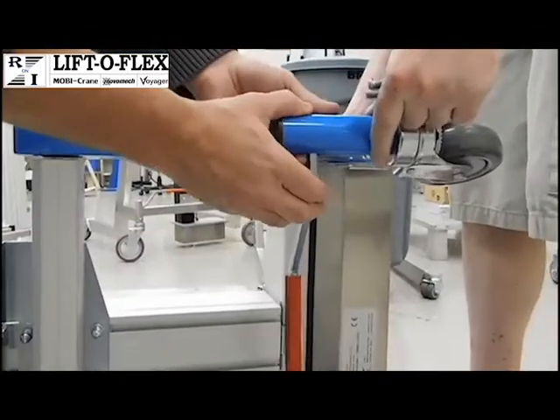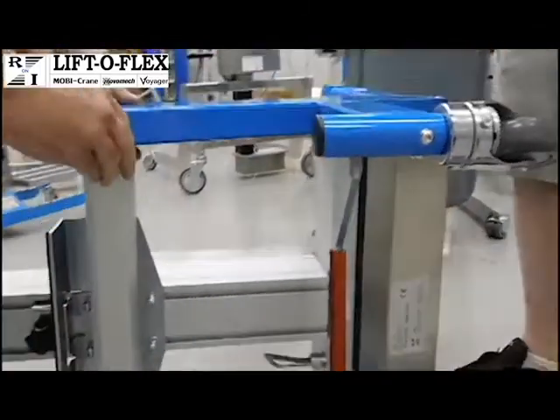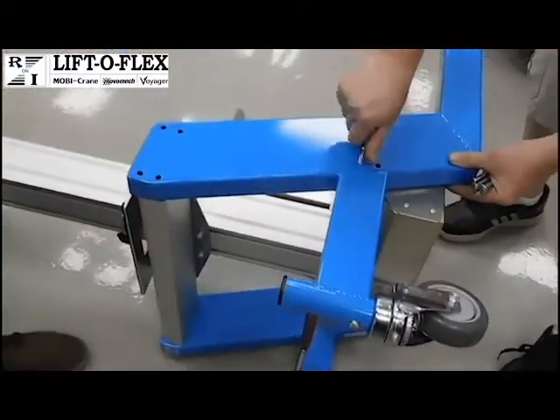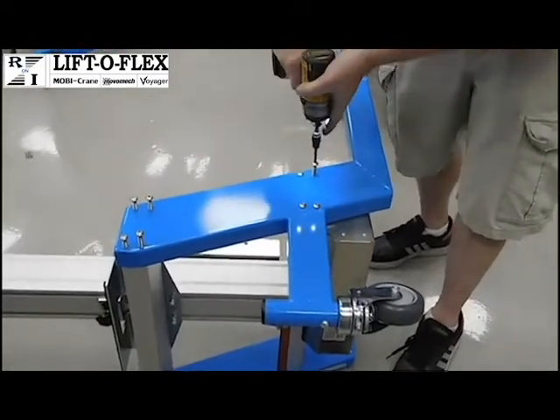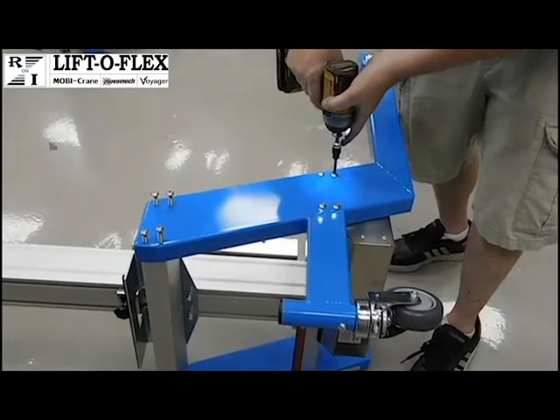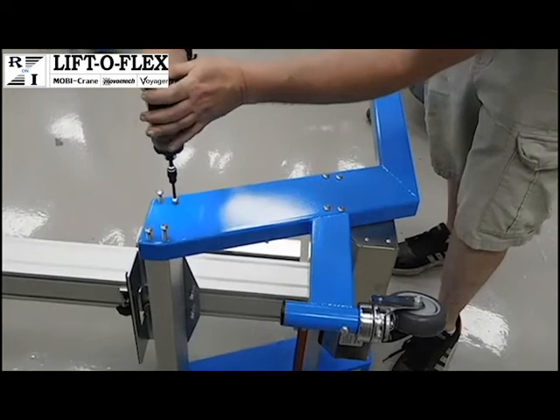You insert the new leg so the brake rod falls in. And then with these bolts, it's the same thing. These need to be hand started as these are going into an aluminum extrusion. And these bolts, before standing up the lifter, just run lightly against the leg, and the final tightening will be done after the lifter is stood up.